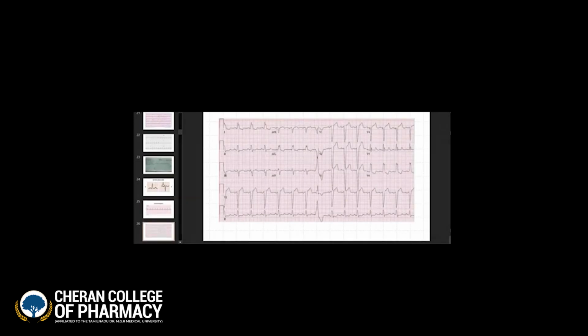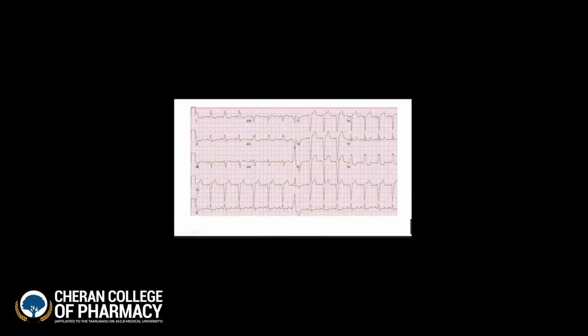Okay, this is the ECG. Come along with me, guys. Just be with me right now. Is AVR negative or positive? Just check the P wave. If it is inverted, then negative. If it is above, then positive. Negative. Okay, negative. Is the rhythm regular or irregular? Regular. Okay, regular. Heart rate, I don't want to calculate. Just come towards the P wave. Which leads are we checking for P wave? Lead 2 and V1. Okay.